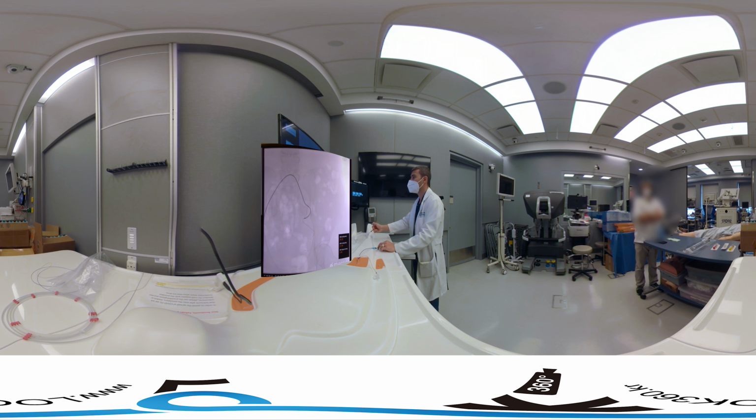All right. We'll do a little injection to show you guys. And right now, we're in that uterine artery. There's a little bit of a downgoing branch, and that's actually the cervical vaginal branch. So what we want to do is get past that. We don't want to be in that branch that goes down. So we want to get a little bit past that.